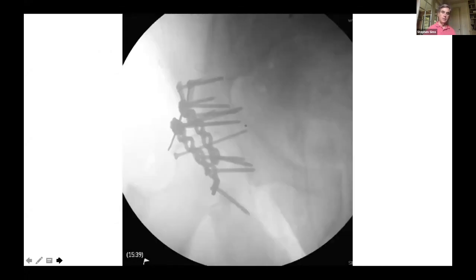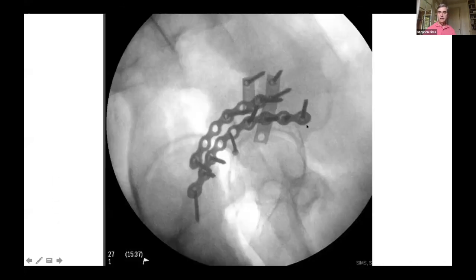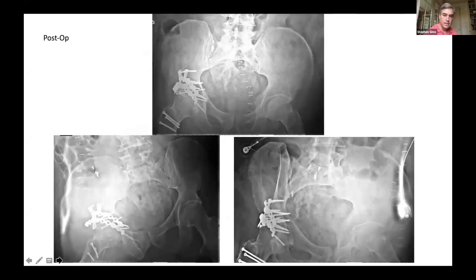And this is what it looks like at the end. I'll go back just to show you that again. One of the points is you can see how we're able to get our fixation. This wall fracture comes all the way out to here, so we're able to get fixation beyond that. To do that, it really requires the screws that go almost all the way to the anterior inferior spine to actually trap that fragment beneath it. I think that would be very difficult to do through any other type of exposure other than a trochanteric osteotomy.